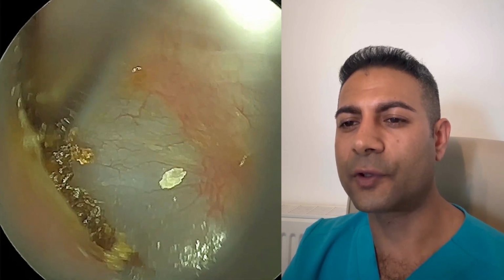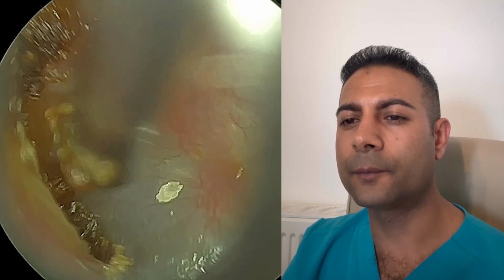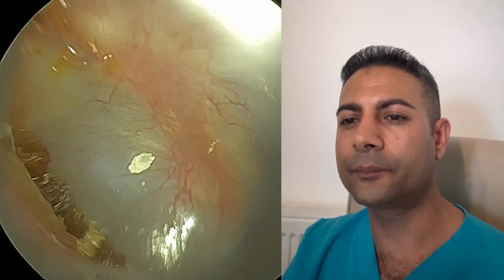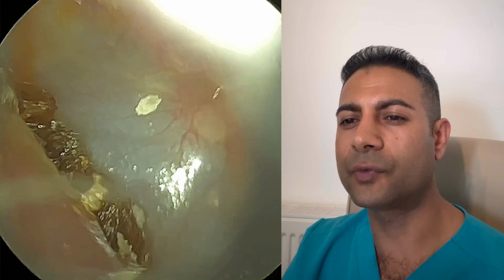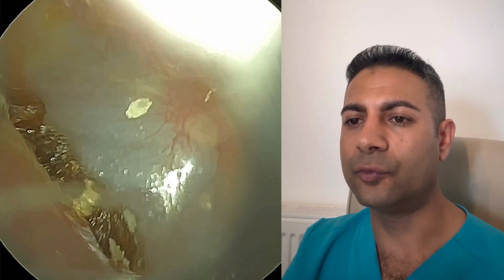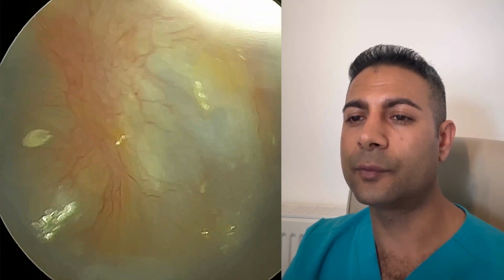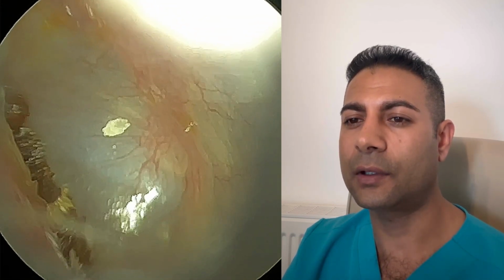So again, just going a bit higher up here. And again, I think it's just a good demonstration of the precision that's possible to move with the WAXscope when removing earwax. So once more, just dilating the ear.